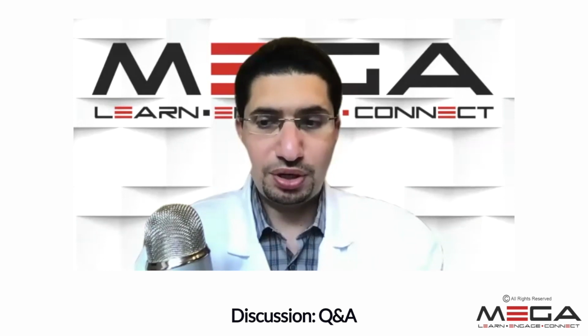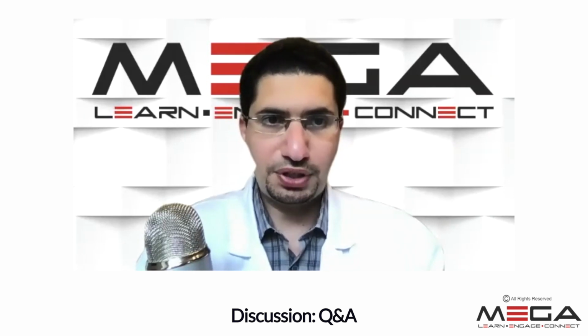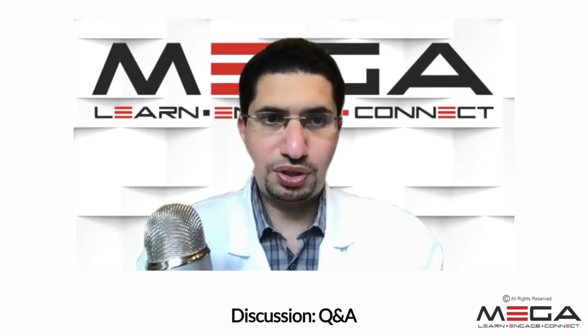But yes, can transthoracic echo be helpful? Yes, it can. But I would caution you not to rule out dissection based on a transthoracic echo. Obviously, if you see it, then it's there. But if you don't see it, then you have not really ruled it out.